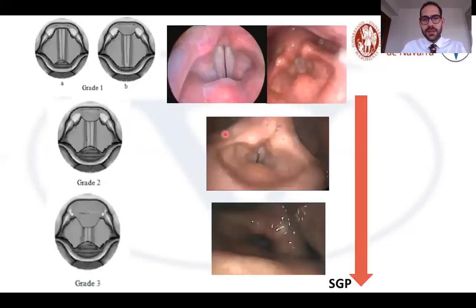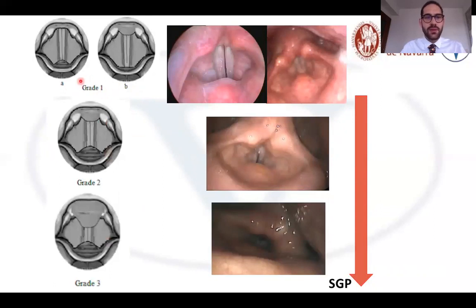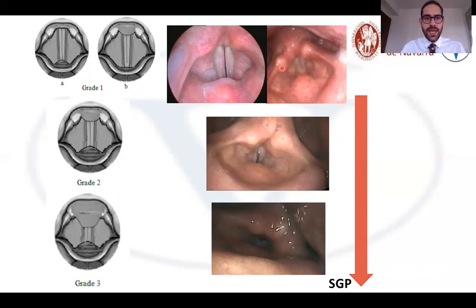With the hypothesis that a higher grade of supraglottic compression might be related to a higher level of subglottic pressure, we divided anterior-posterior compression into three grades. In grade 1a, we cannot see the posterior commissure due to the contraction of the arytenoids. In grade 1b, we cannot see the vocal cords due to the rotation of the arytenoid during the speech task. In grade 2, we see only two-thirds of the vocal cord. In grade 3, we see less than one-third of the vocal cord.